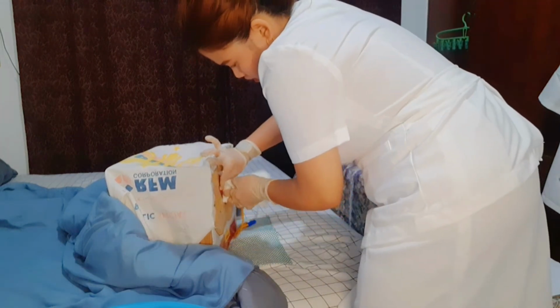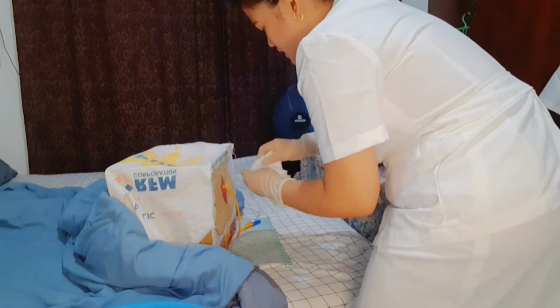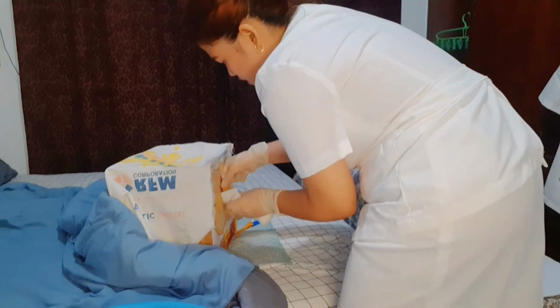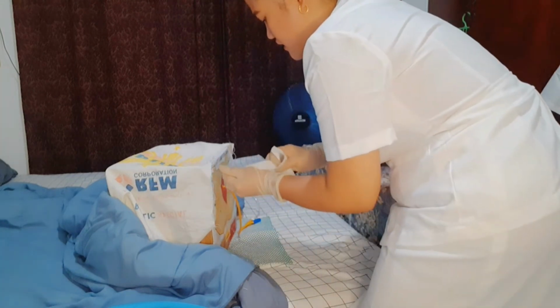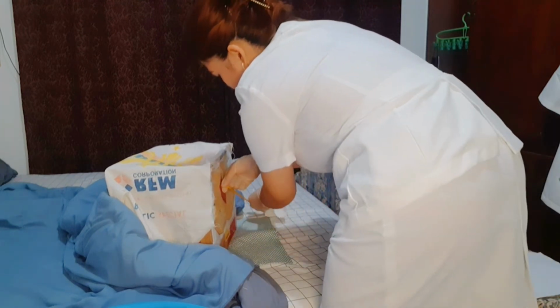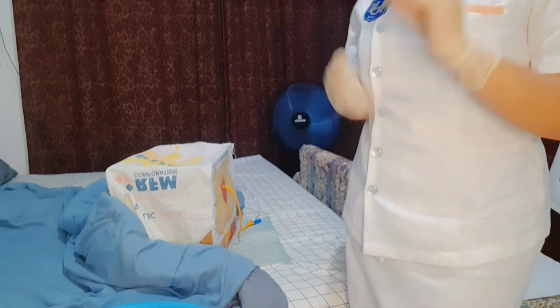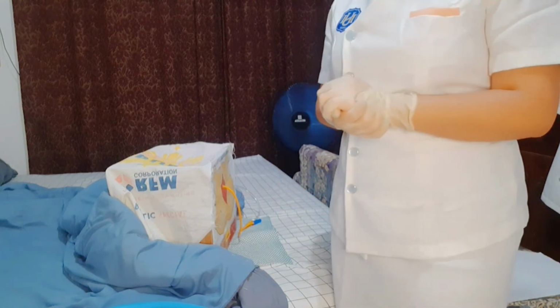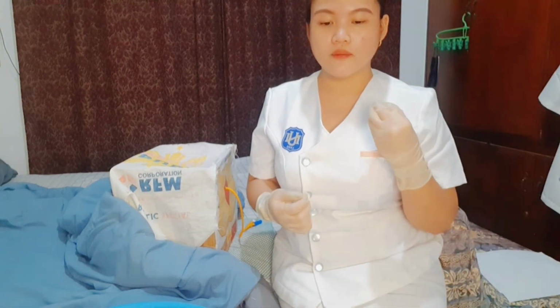Again, using the first stroke, you hold this one in order not to move it. Okay? And then the next one, hold the catheter and then clean it. And then the third stroke, hold it and then clean the catheter again. And then dispose of it. Be sure to repeat the catheter care anytime it becomes soiled with stool or other drainage. It is in order to prevent infection.